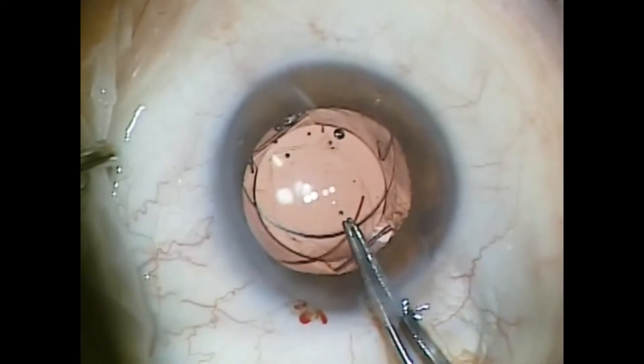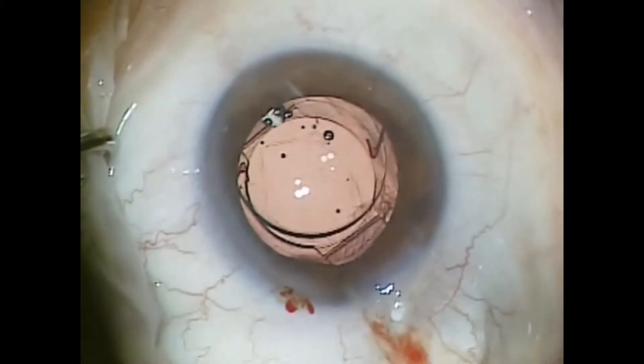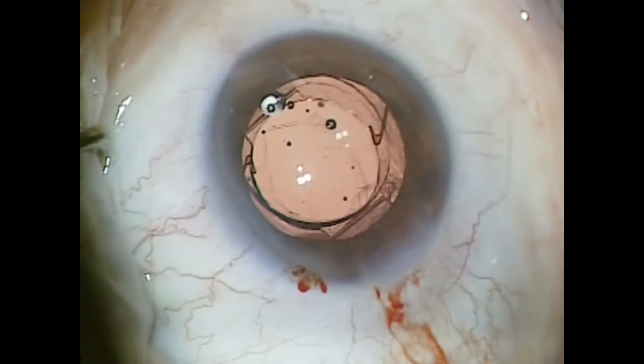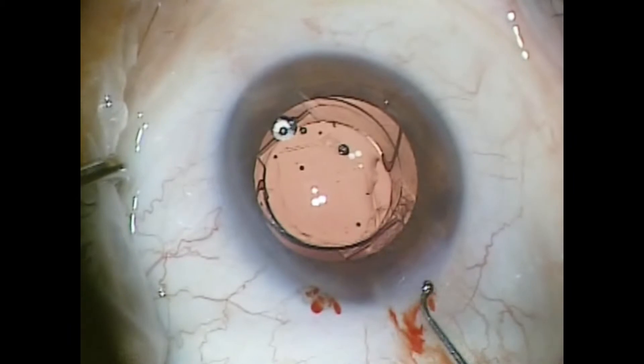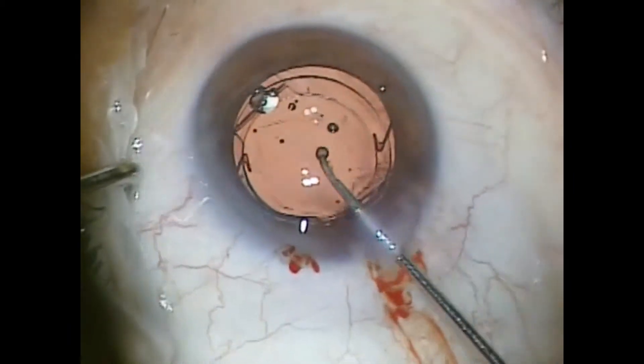I usually like to leave the lens in a position that is perpendicular to the underlying lens implant, but this is not absolutely necessary. I'll make sure the lens is well seated.